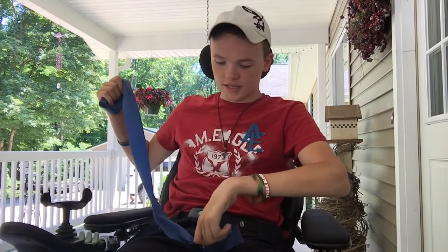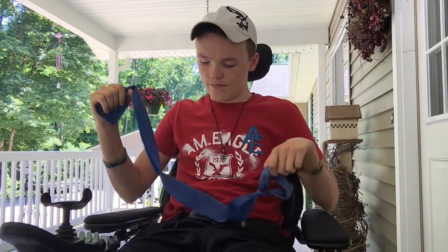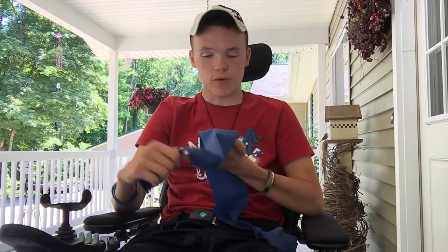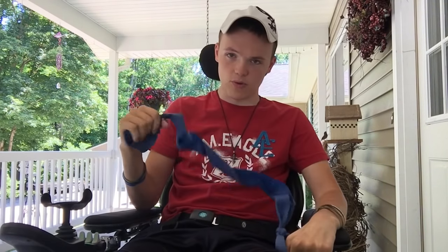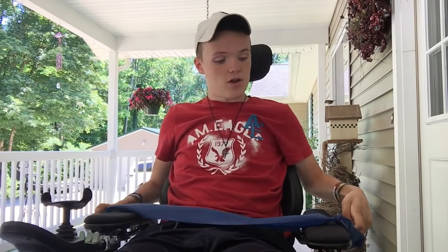But what this is, a TheraBand, and it's normally, well, you can see how wide it is, like that. It's probably about 4 inches in width, and they're normally on rolls, and you can just cut it to whatever length you want. And I'd say this one is about arm's length. It's about like this, if I spread out my arms.